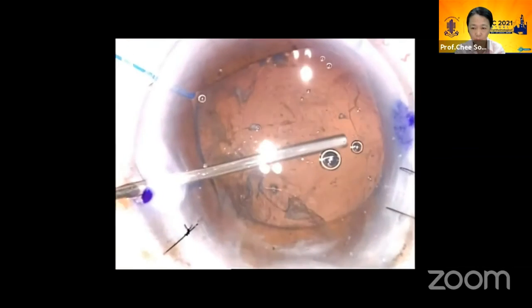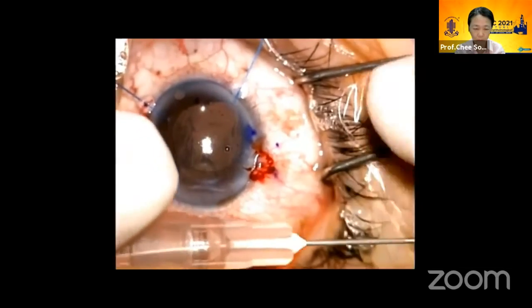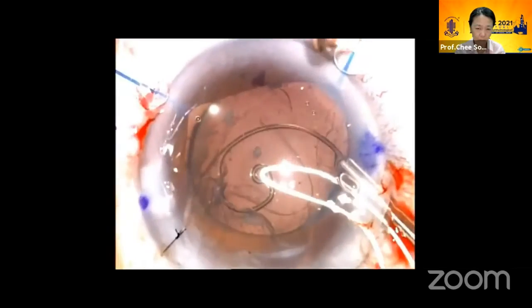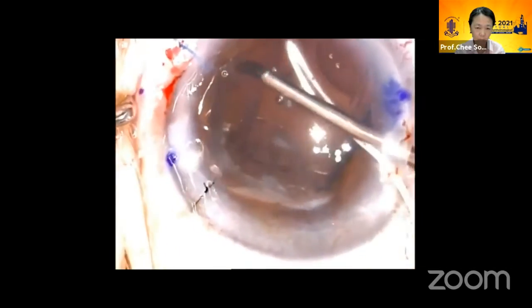You can see an area here where I've actually ripped the anterior capsule. Because of that, I'm not able to use a capsule tension ring. In this case, I'm going to use 2 capsule tension segments to support the capsular bag in order to spare this multifocal toric lens.